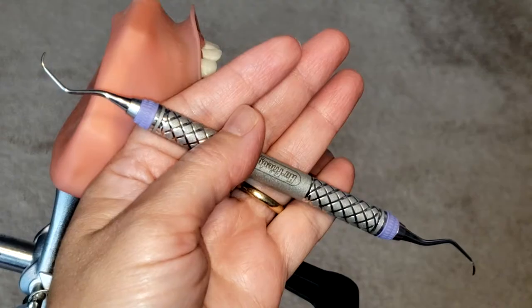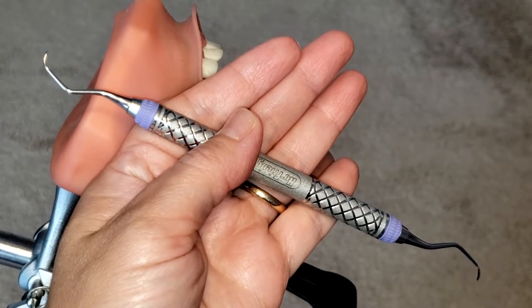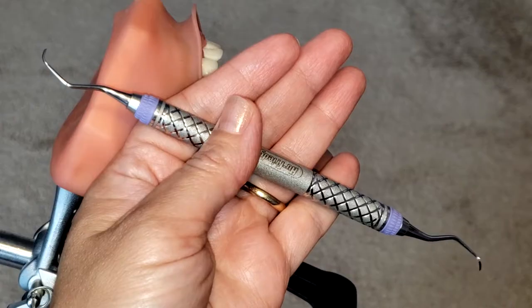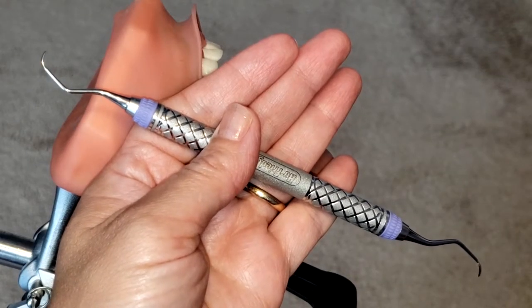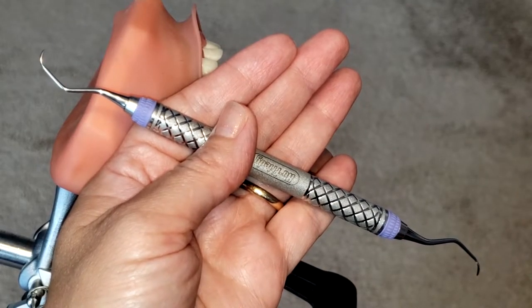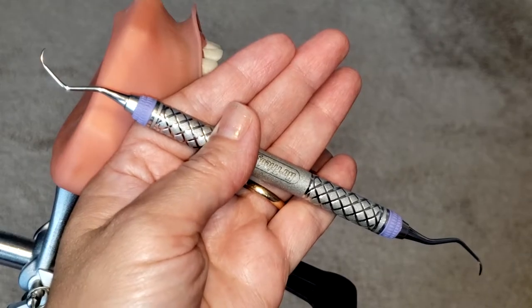Hello, everyone, and welcome. Today, I'm going to be showing you how to use the Gracie 7-8 area-specific curette. Now, this instrument is specifically designed for the posterior teeth — so those molars and premolars — facial and lingual surfaces, and it is great for moderate to heavy calculus removal.